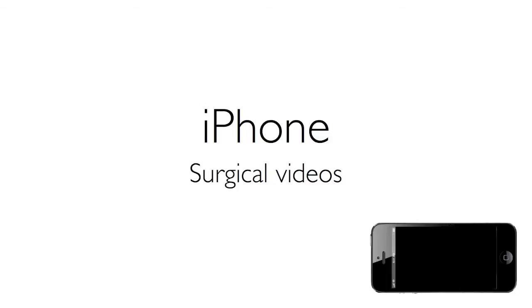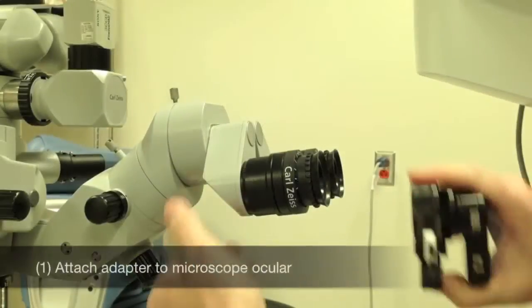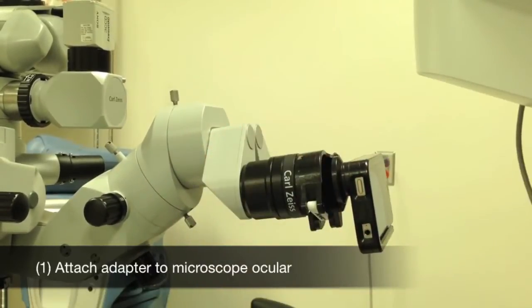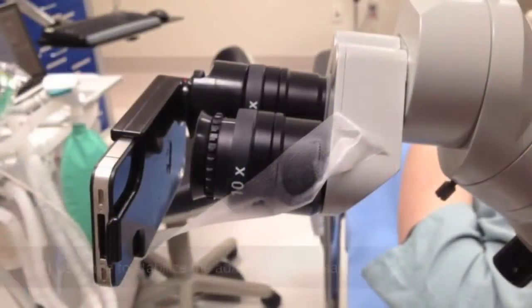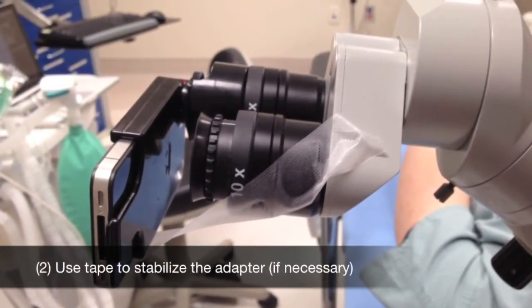Recording surgical videos on an operating microscope is very similar to shooting slit lamp videos. Actually, it's even easier. You'll need a different adapter, but you'll still use the Pro Camera app. Here's how to record surgical videos with the iPhone. First, attach the adapter to the assistant scope — a horizontal orientation will optimize the view of the surgical field. Unfortunately, sometimes tape is necessary to maintain proper positioning.